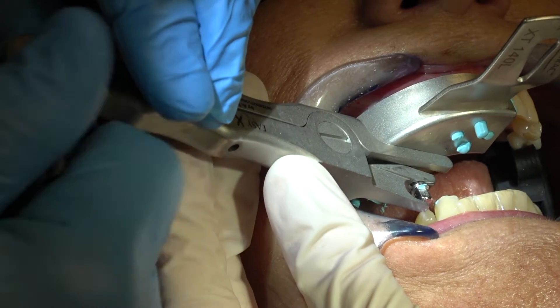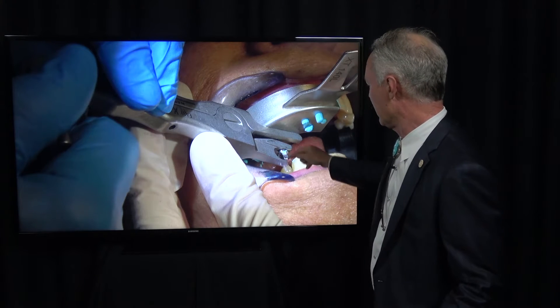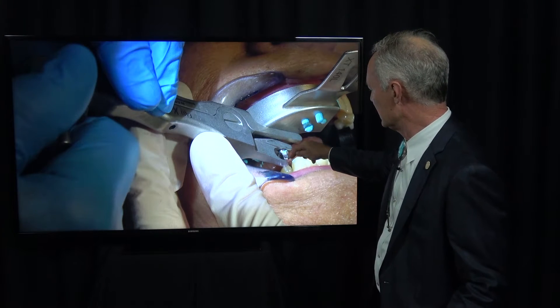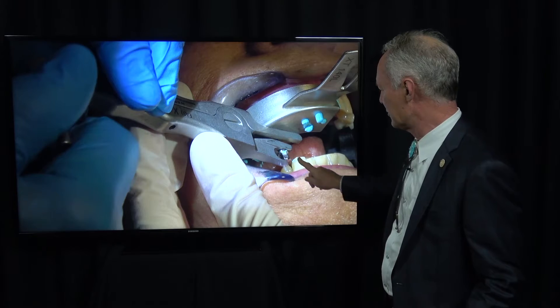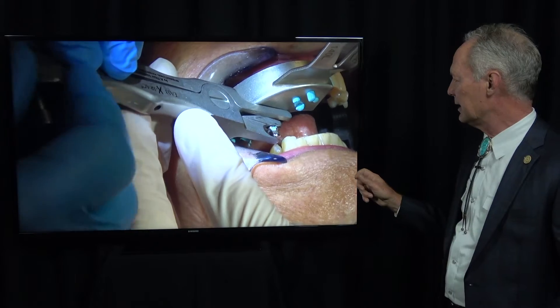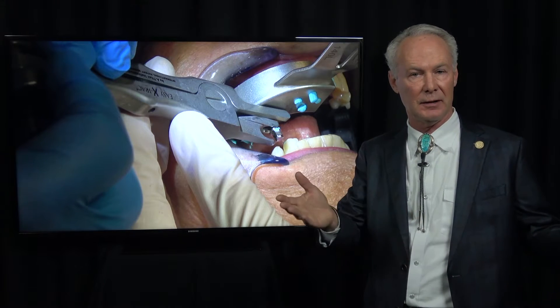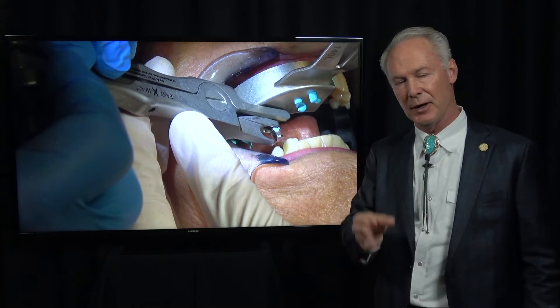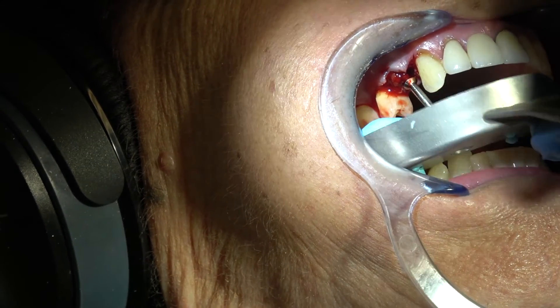Let it sit for a minute. There's a little knob that you screw — righty tighty — as you screw it to the right, it moves the post up slowly, wedging against the teeth on each side. It's pulling the root straight out. Screw it until it gets really tight, then leave it. Go check a hygiene patient, wait three to five minutes. Many times when I return, the tooth is already removed. You can see it loosened — take this off and here it comes.